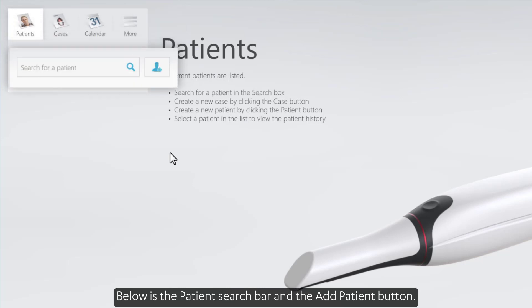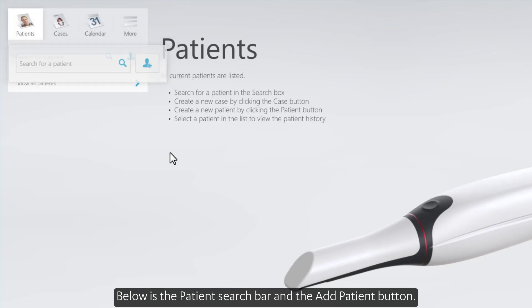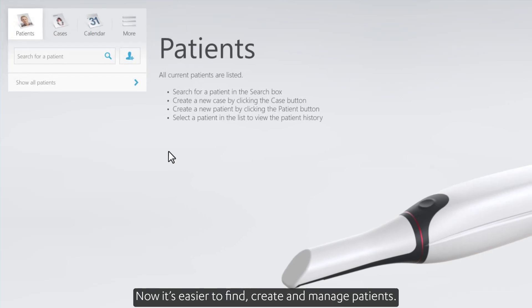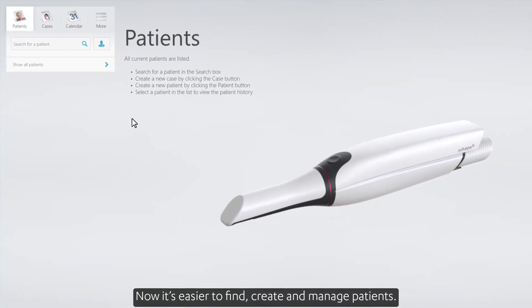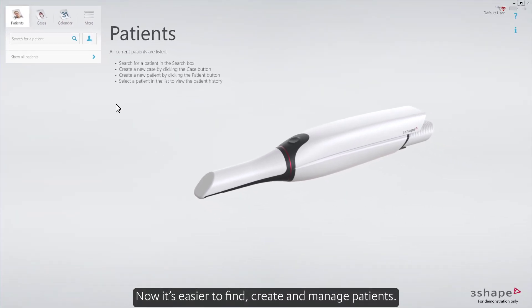Below is the patient search bar and the add patient button. Now it's easier to find, create, and manage patients.